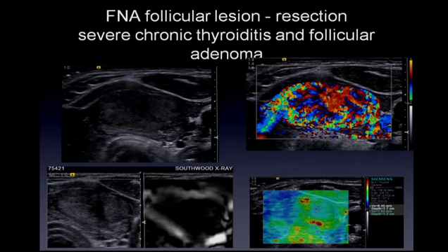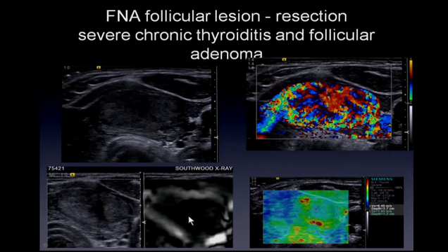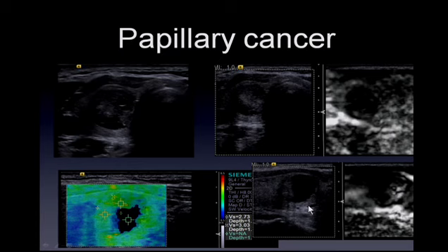This follicular lesion turned out on FNA and resection to be severe chronic thyroiditis and a benign follicular adenoma. The lesion is just minimally hypoechoic to normal thyroid, slightly heterogeneous, and incredibly vascular on color Doppler. On strain imaging, there is a softer component and a harder component. On shear wave imaging, velocities are approximately 6 meters per second, more suggestive of a malignant lesion than a benign lesion—which it turned out to be.